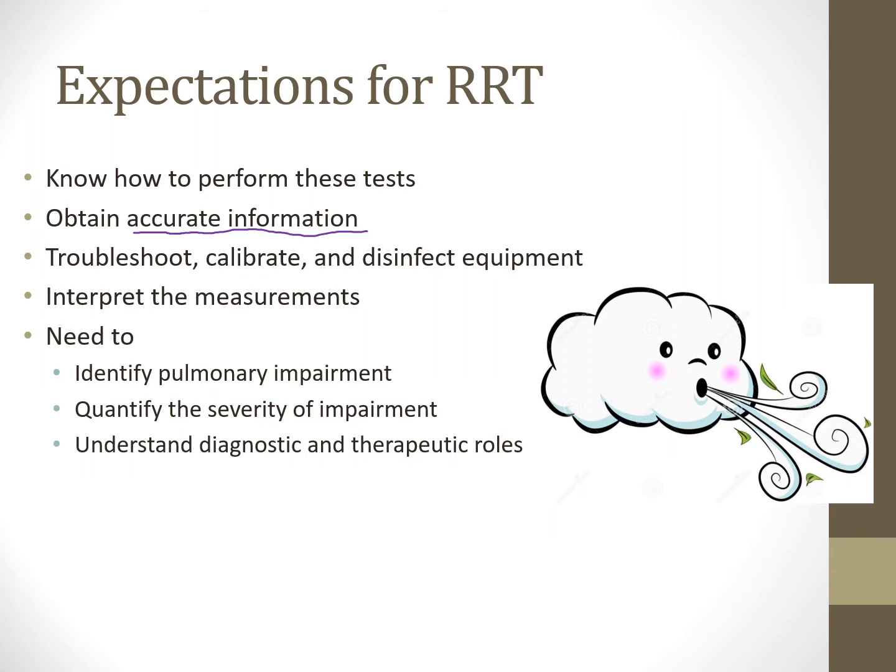And every day that I used to do 1 day a week in our PFT lab, I would have to calibrate. Every day that we use that machine on a patient, you have to have it calibrated before you use that machine for that day, because that shows that the data we're collecting from that patient is accurate. So it's just like taring a scale, right? If you've ever done chemistry or science and you had to tare a scale, make sure the equipment is calibrated and zeroed out before you start measuring things. And that's exactly what you're doing here. You're just making sure the machine's measuring the flow rates well, it's measuring the volumes well.